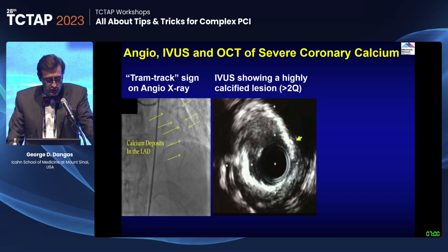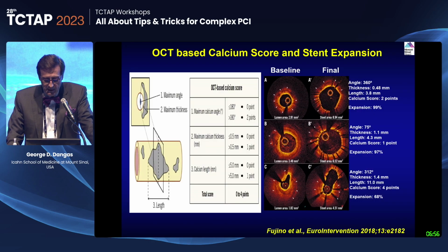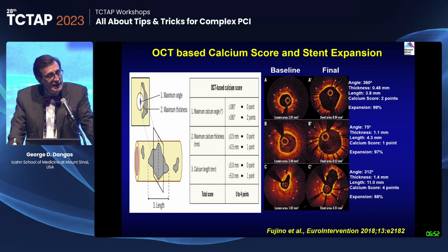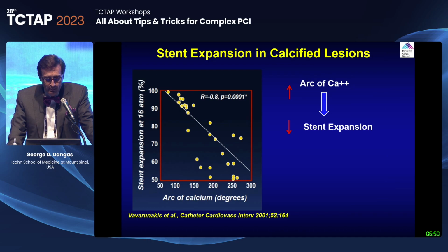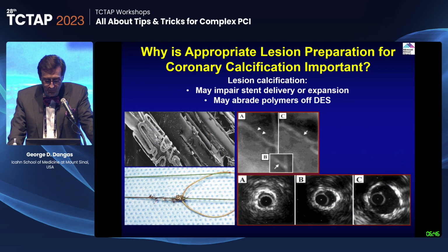These are the definitions of severe calcium. You can see the track and all that Dr. Mintz explained very well, as well as the point system regarding how to get the calcium assessment per patient, and as well as this aspect.